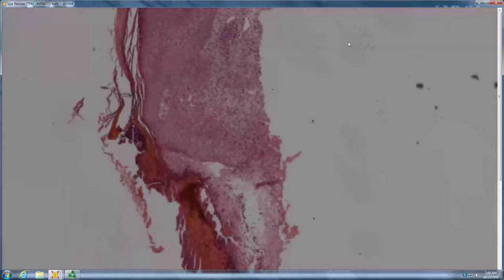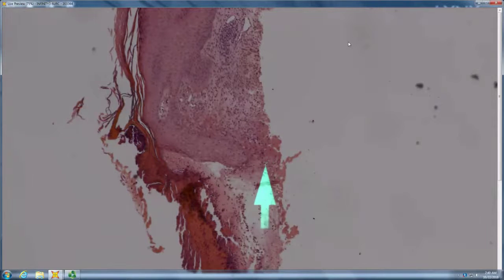So, another little ulceration. What's under the ulcer? Maybe some granulation tissue. Well, there's certainly granulation tissue to the side, but what's this intensely staining stuff? Fibrin. So, an ulcer with underlying fibrin and granulation tissue flanking it on either side. Like CNH, but I don't see cartilage. It still could be it. Yep, and if the biopsy was done well, it probably would not have cartilage, right?